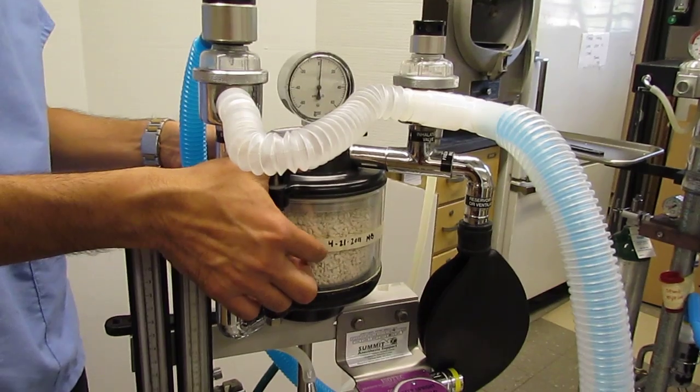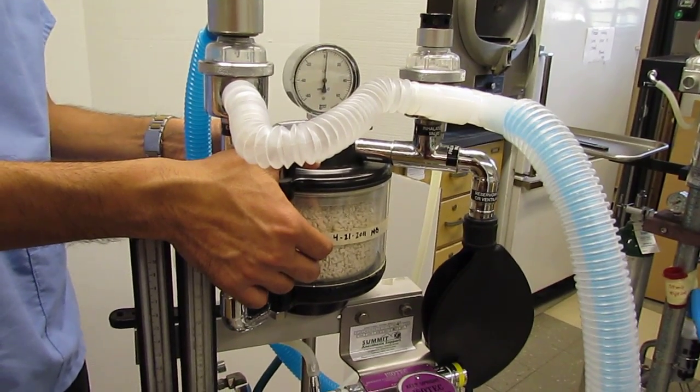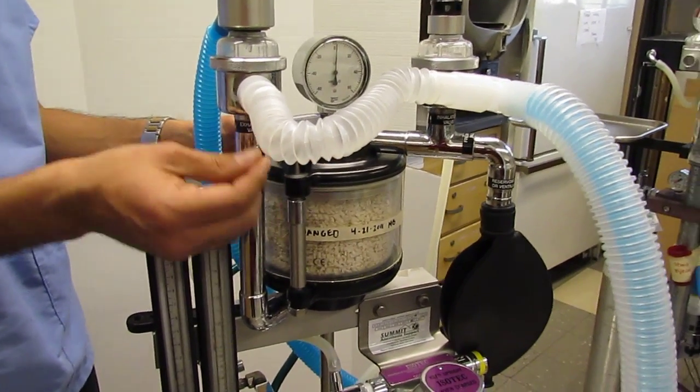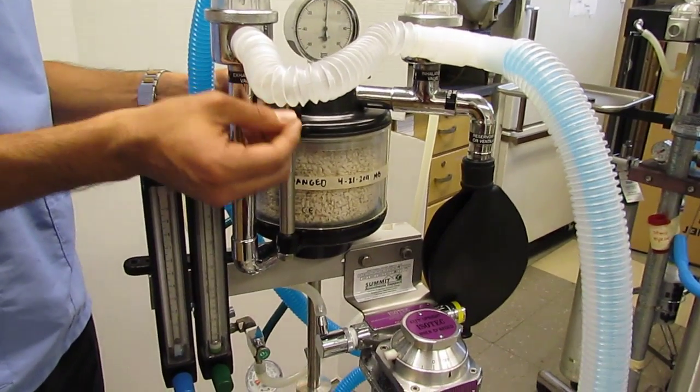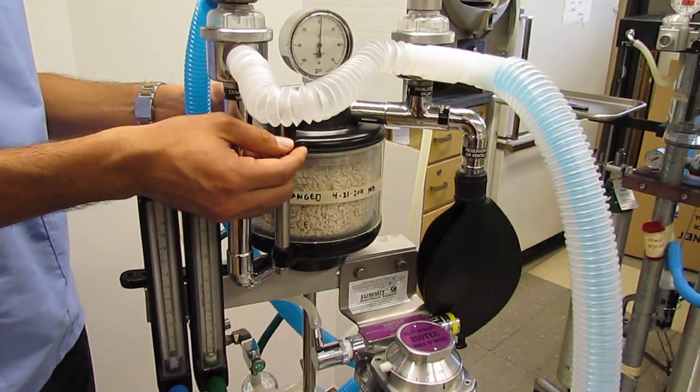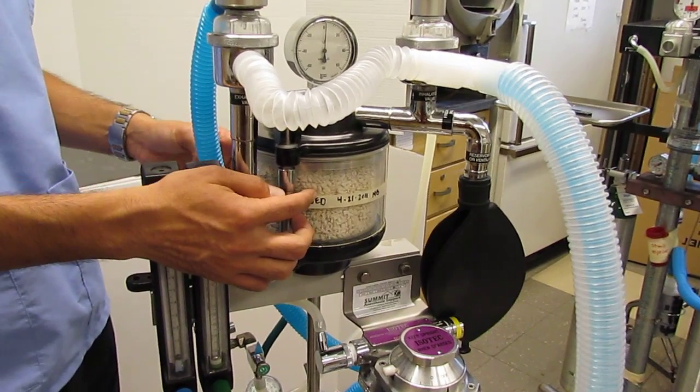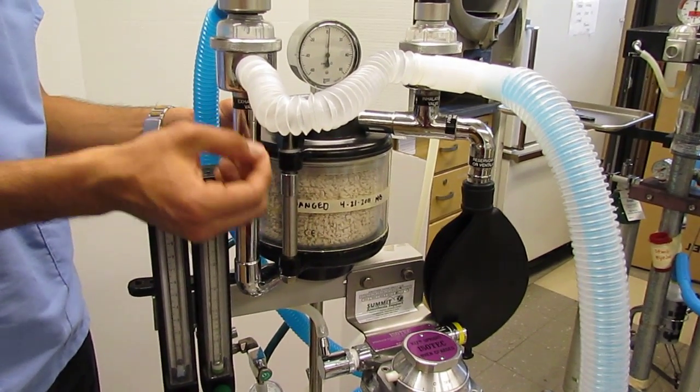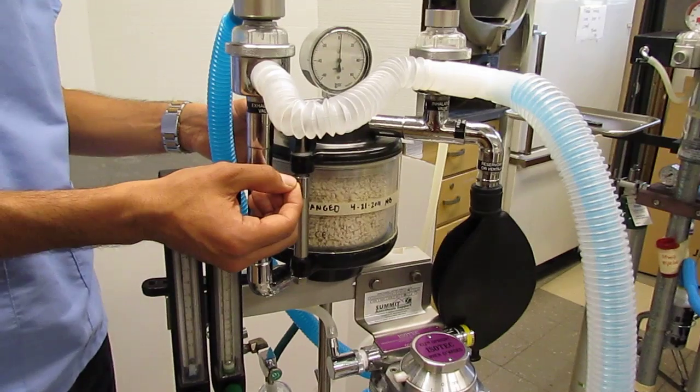It pulls CO2 out of the circulating gas through a chemical reaction that makes the sodalime go from a soft granular structure to a very rock-hard structure. So one way you can tell that your sodalime has been exhausted is by actually trying to crush it. And if you can't crush it, then it's been exhausted.